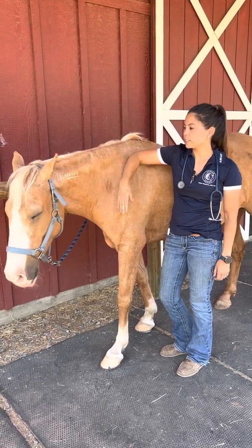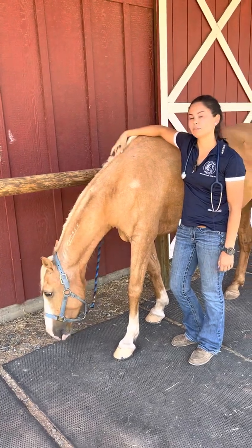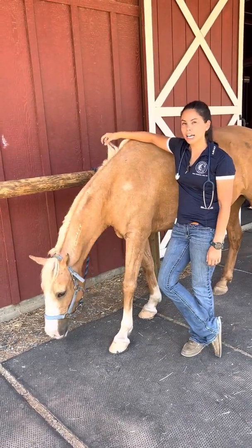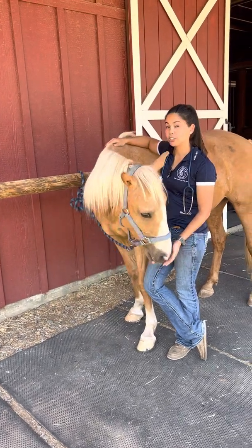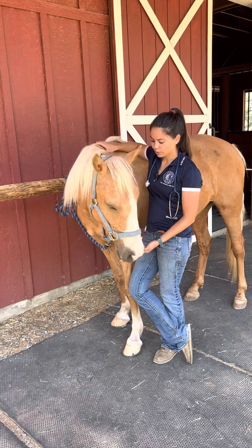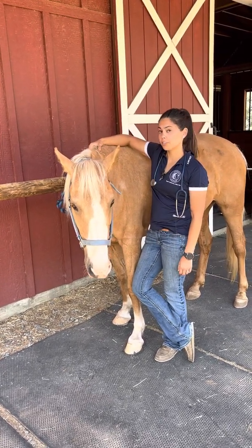So, normal vital signs on a horse: the heart rate should be between 28 and 40. Anything over 40 is a little bit high. Anything over about 52 is really high, definitely an emergency. For temperature, if it's over 101.5, then that's a fever.